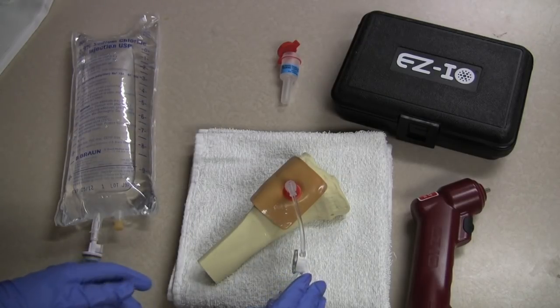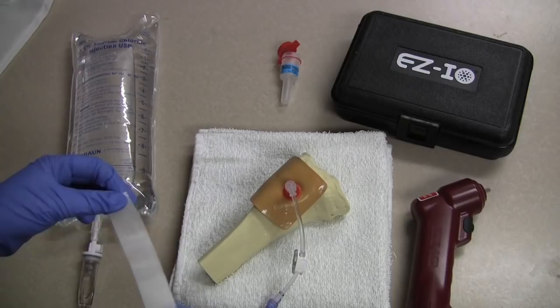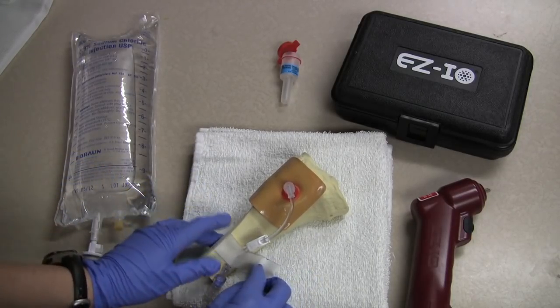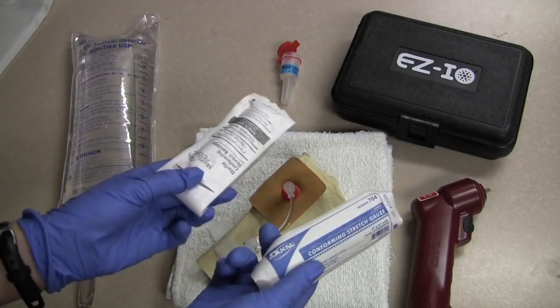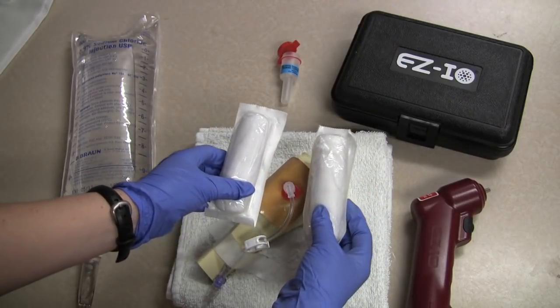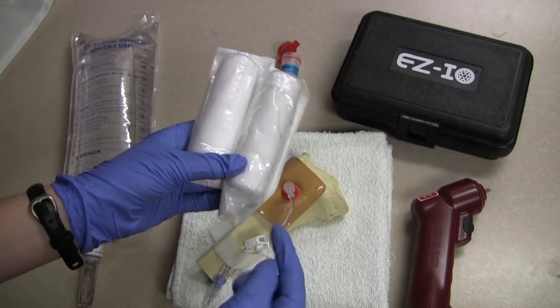Next I want to secure the IO. The device itself secures pretty well against the leg, but this is your only IO access, so it is pretty important to secure it. Now this is almost like a penetrating wound, so I am going to take my two bulky dressings and place them on either side of the IO, and take some tape and secure those to the leg.